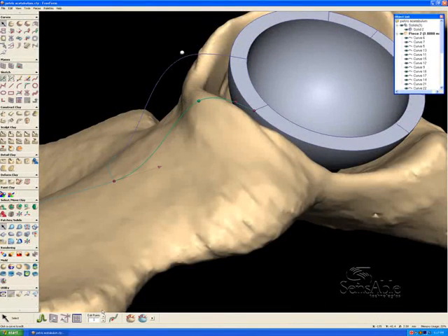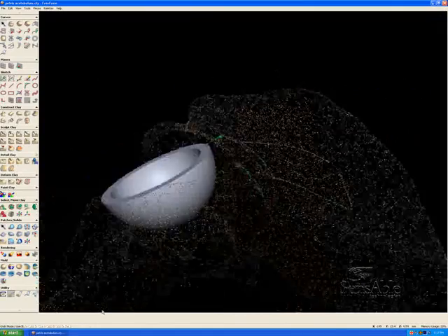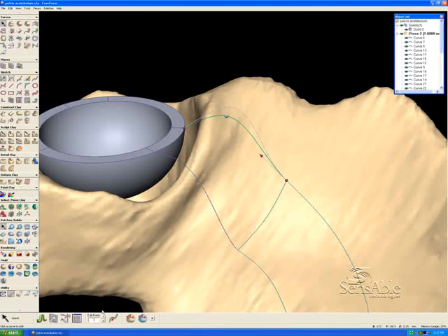I'm rotating using the G key and the movement of the haptic device to simply orient my view so that I know how this is going to undulate across the surface. So let's go ahead and create tangency as well with this shared curve right along there.